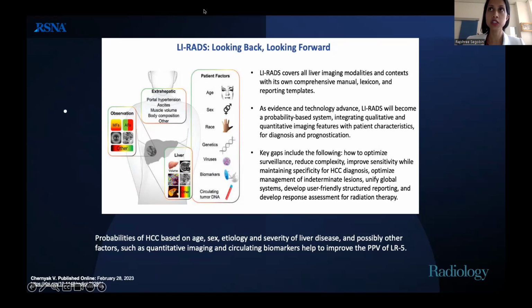So in longitudinal reporting, you can subjectively compare. But if you have a de novo lesion in a new patient, it would be very difficult to quantify how avidly this lesion is appearing as hyperintense compared to the liver parenchyma.